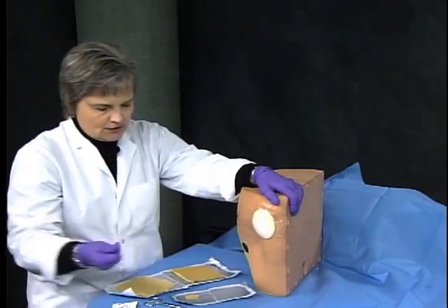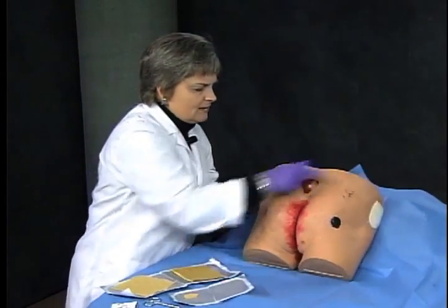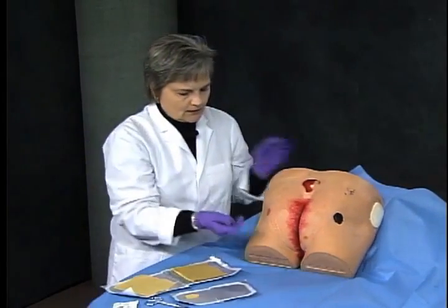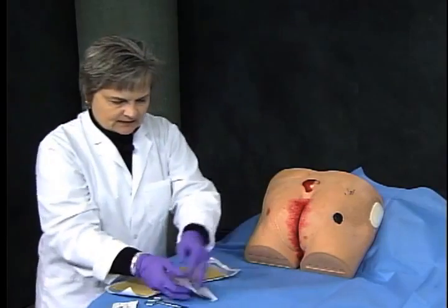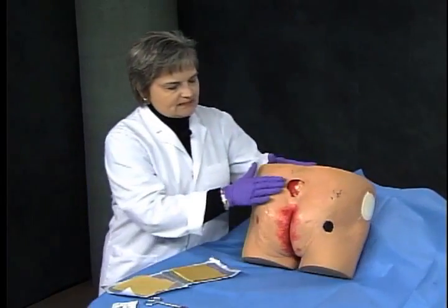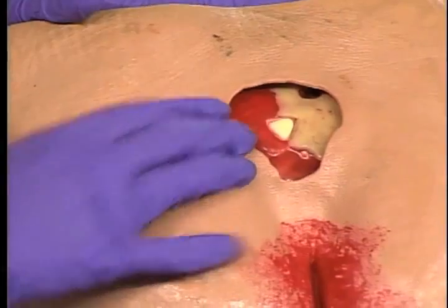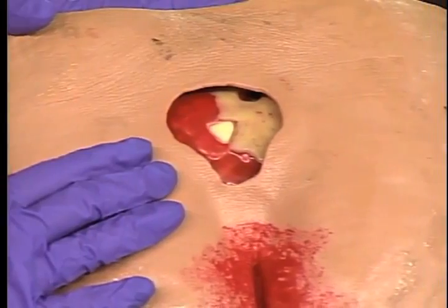All right? So now let's look at another application. Let's say you have a much deeper wound. Move this out of the way. You can see this is a much more serious and deep ulcer representing a pressure ulcer over the anatomic model sacrococcygeal area.